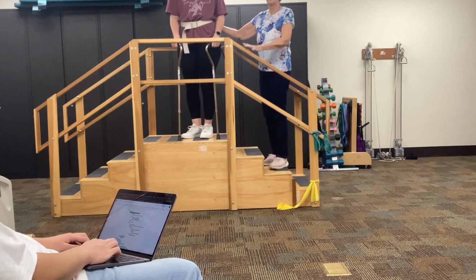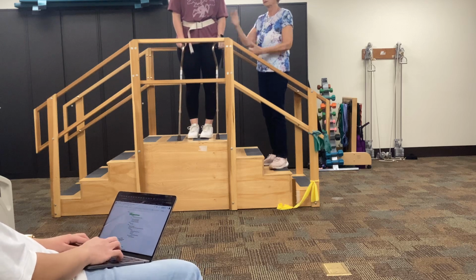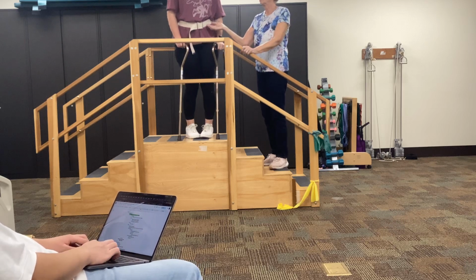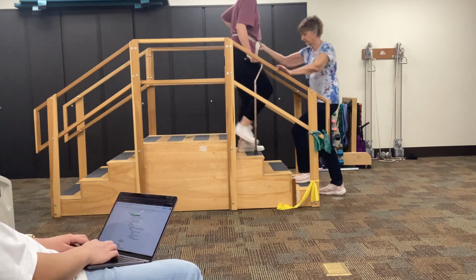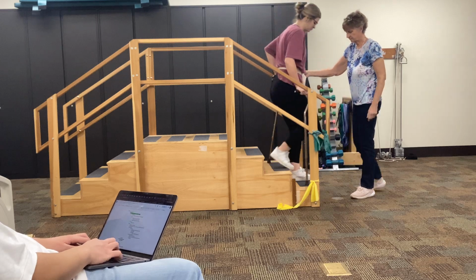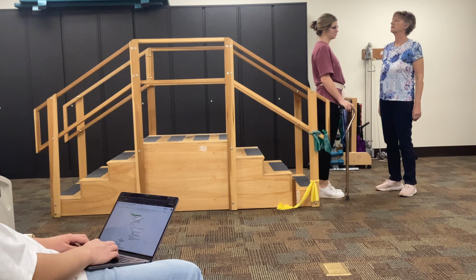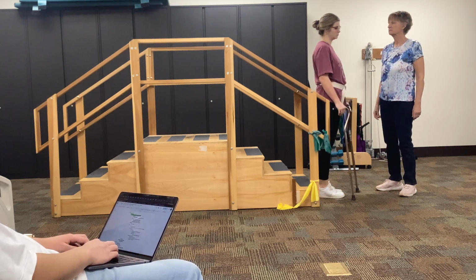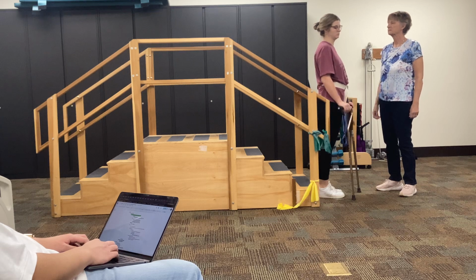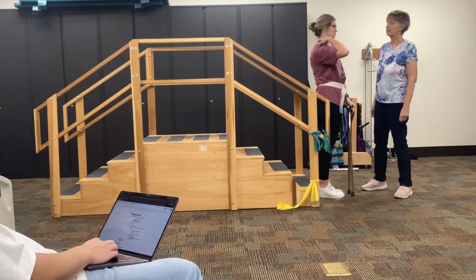Okay, then up with the good, down with the bad kind of doesn't play a part because she's going now step over step with her foot. Okay, and come on down. So which one was the easiest? Probably that one. Okay, which one did you think felt the most stable? That one probably. Really? Okay. As opposed to the first or the second one? Maybe the second one. Okay.